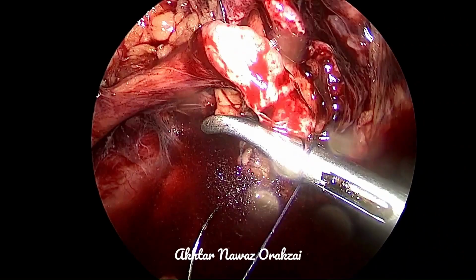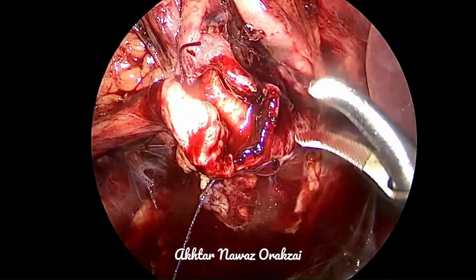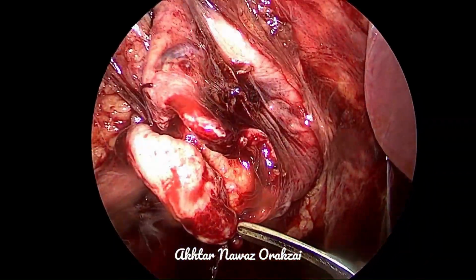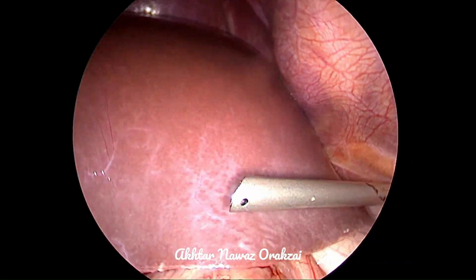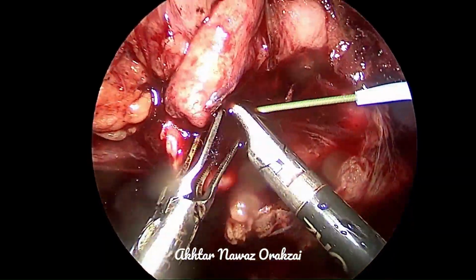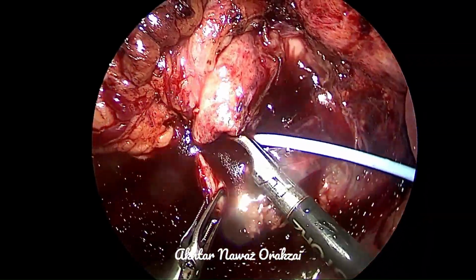However, in laparoscopic pyeloplasty, as I perform this transperitoneally, the preference here would be to remove the drain as soon as it is dry. Usually it takes 24 to 48 hours. And then I keep the catheter for a minimum of 1 week, because any leakage transperitoneally can be cumbersome. Now here you can see that this is the way of placing the DJ stent.